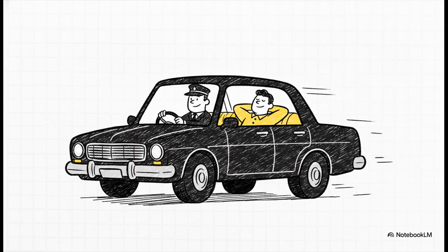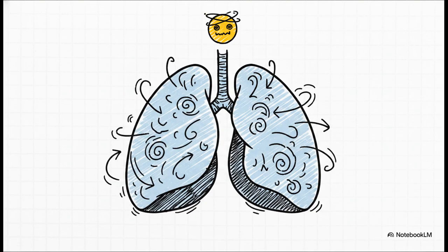You set a minimum respiratory rate and a target volume or pressure. If the patient does nothing, the machine breathes for them at that set rate. But if the patient manages to initiate a breath on their own, the machine senses it and, bam, it instantly delivers a full, completely supported breath. Because it offers so much total support, AC is often the initial mode of choice for critically ill patients first rolling into the ICU, especially if they're heavily sedated, paralyzed, or have severe central nervous system dysfunction.